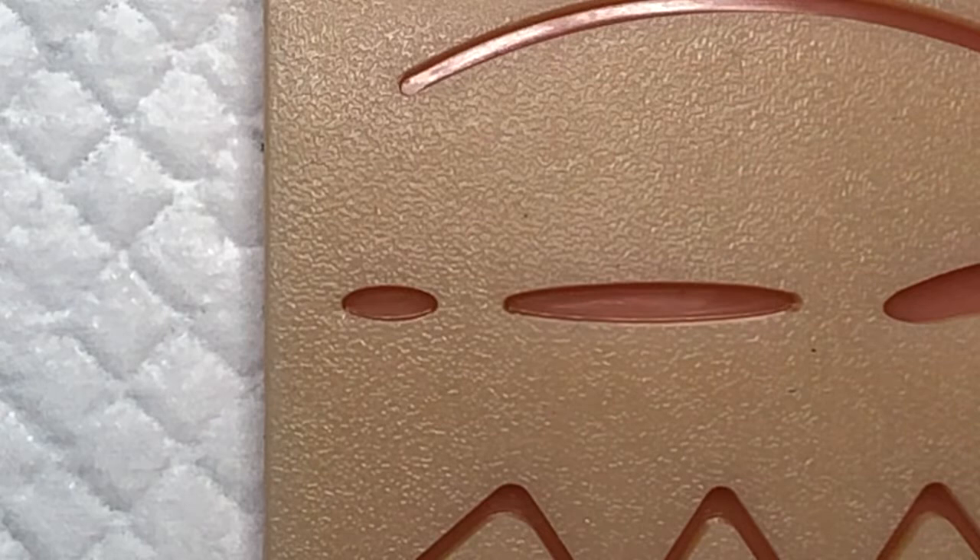Hey everybody, it's Patrick O'Malley again with the laceration course. We're going to do a quick video on a figure-of-eight stitch. This is a very helpful stitch if you've got a bleeding varicose vein. I've seen patients who've come in after a heart catheterization with a small puncture wound in their groin that just continues to ooze, or patients on anticoagulants who have something that's bleeding — maybe a small, superficial laceration or abrasion.